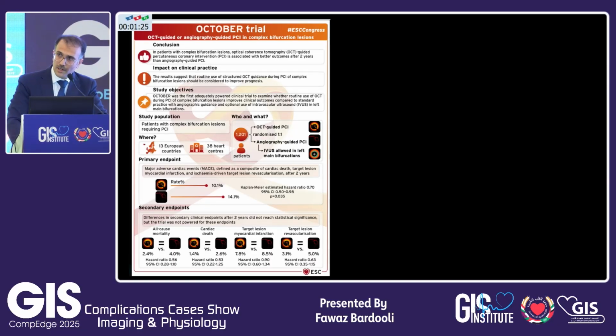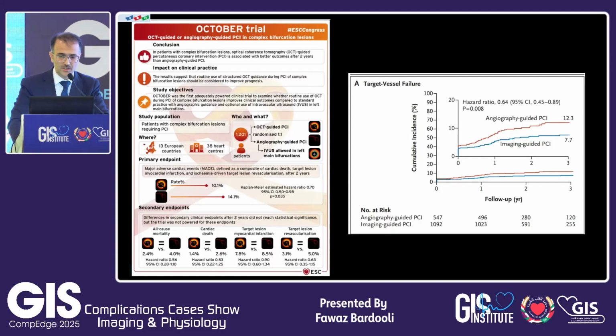Very quickly, two things I want to mention here. The OCTOBER trial is a fantastic trial that deals with bifurcation, and it shows that if you do imaging in bifurcation, you will have a better result, as well as the RENOVATE trial in complex PCI lesions.